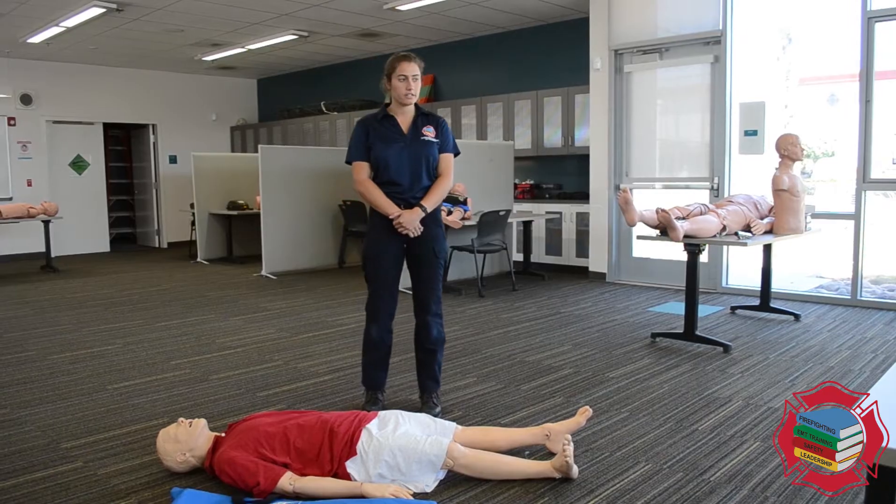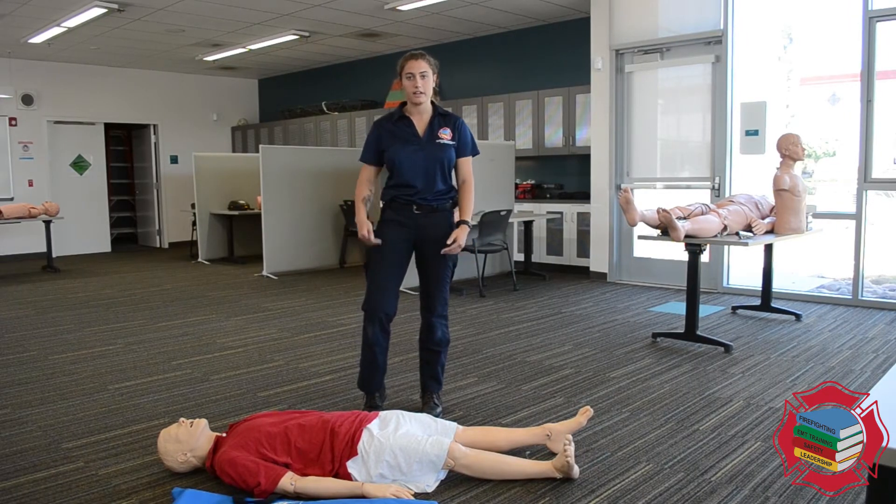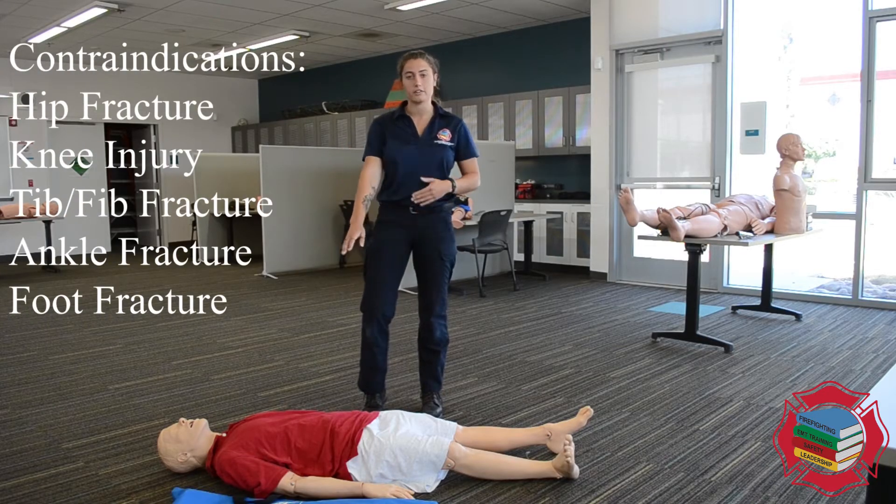The indication for using a traction splint is going to be a midline femur fracture. Contraindications would be any other fracture in that area. If the hip is fractured, we cannot use a traction splint.